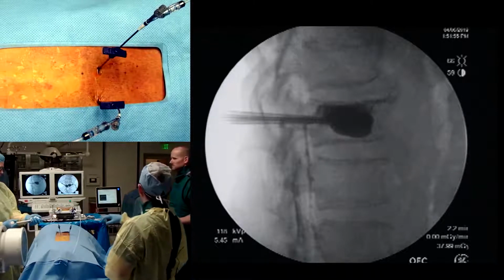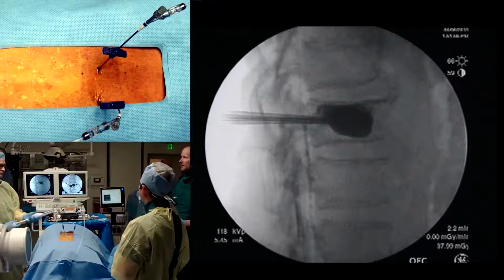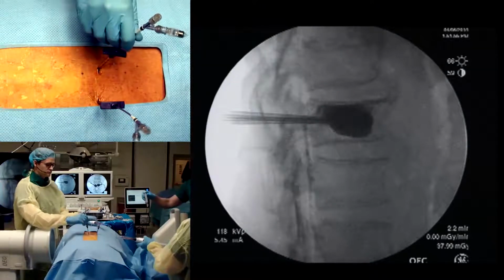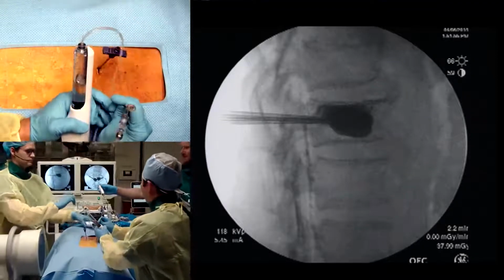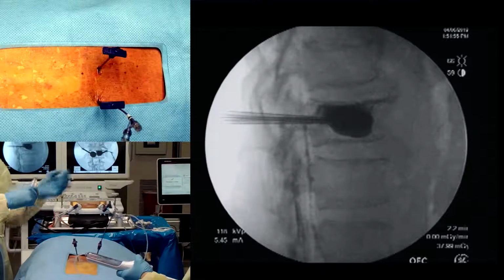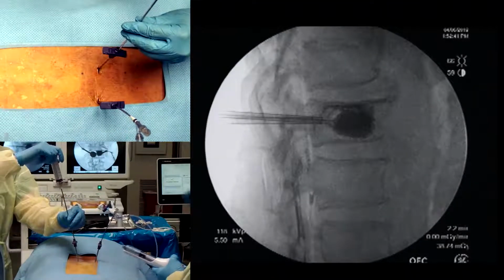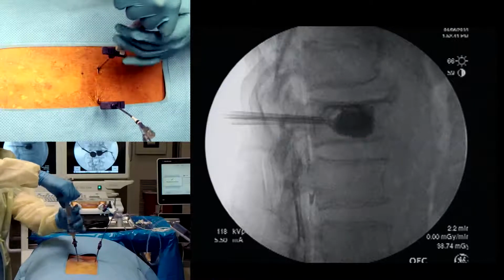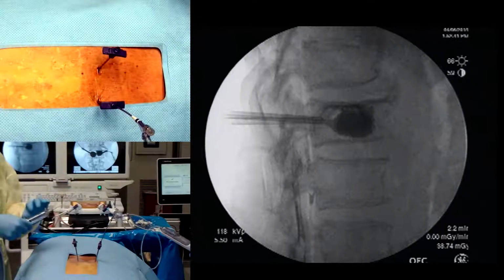So why don't you undo that? And we won't need to replace this. We'll go straight to cement. I want to see where the cement actually goes, so we're both going to take our pressure off the balloon there. And let's see where we're at when we take these out. Picture that. Let it squeeze and pull all the way back. Okay, and then just let go. I'll take a picture.